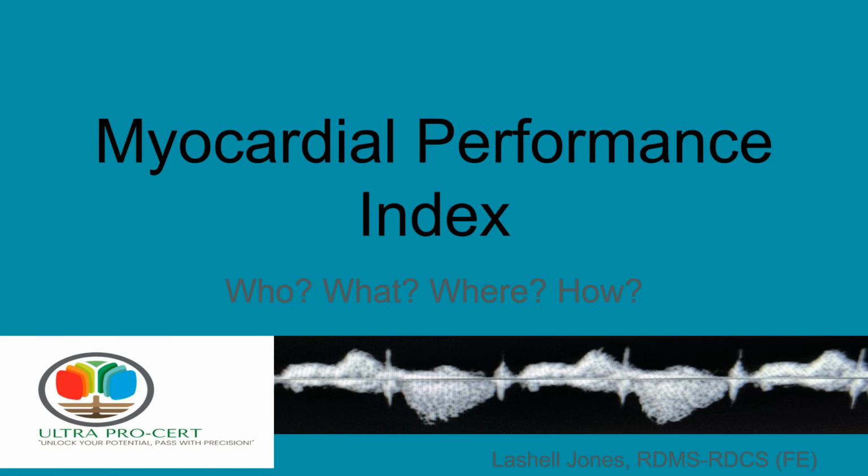Welcome to this video on the Myocardial Performance Index, or MPI. We will explore what it is, where it is used, and how it is calculated.